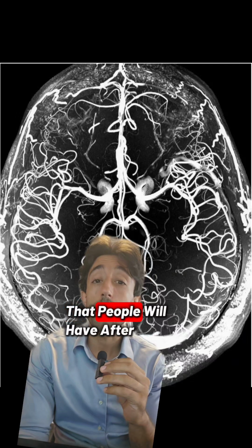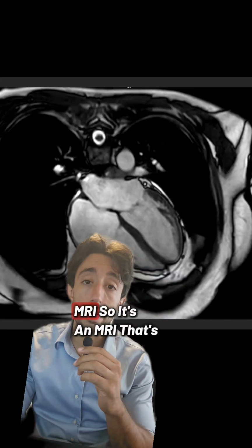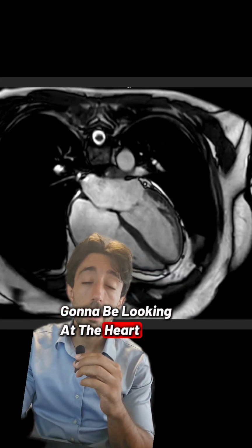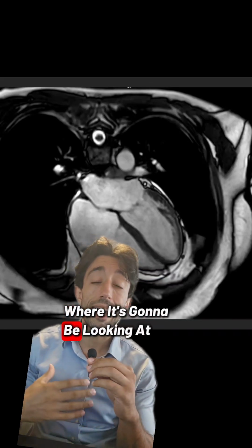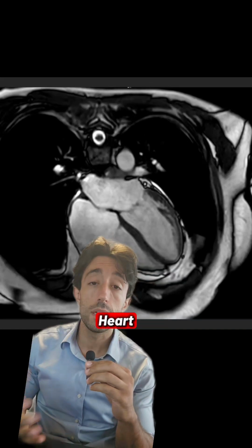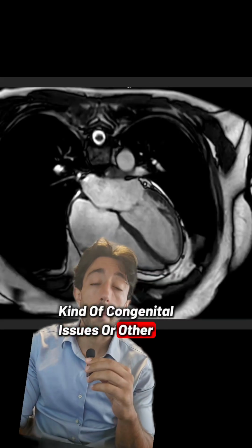And this is a very common one that people will have after strokes, and looking at what's called the circle of Willis. And here we have a cardiac MRI. So it's an MRI that's going to be looking at the heart. This can either be as more of a live MRI, similar to the fMRI, where it's going to be looking at the function, the pumping of the heart, but it can also help to look for any other kind of congenital issues or other pumping problems.